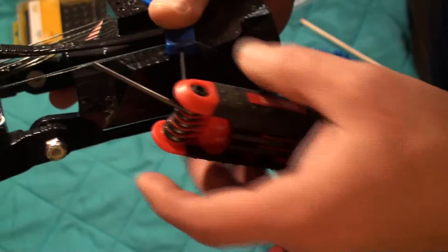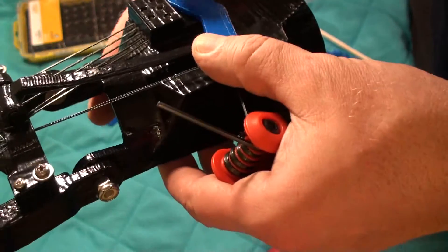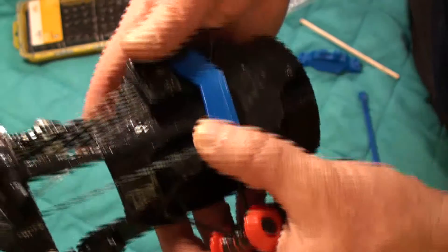I should put the pivot cover on before I unscrew this, because it does a lot to keep this thing stable.